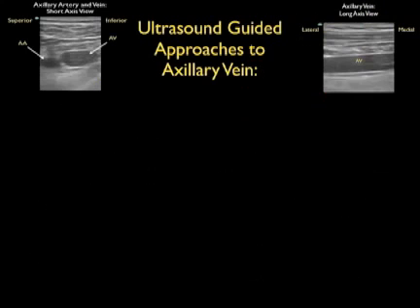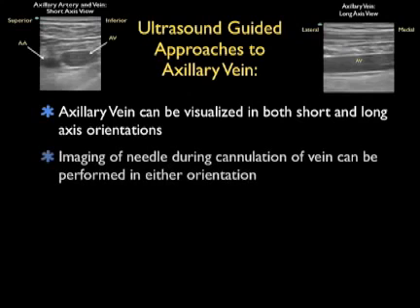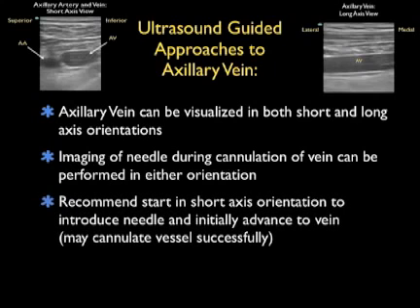Now let's specifically discuss some of the ultrasound-guided approaches to axillary vein cannulation. The axillary vein can be visualized in both short and long axis orientations using ultrasound. Imaging of the needle during cannulation of the vein can then be performed in either orientation, and there are pluses and minuses of both of these orientations for cannulation of the vessel.